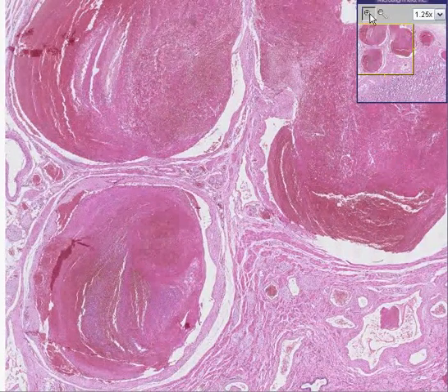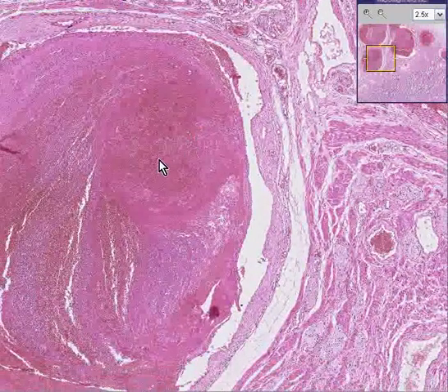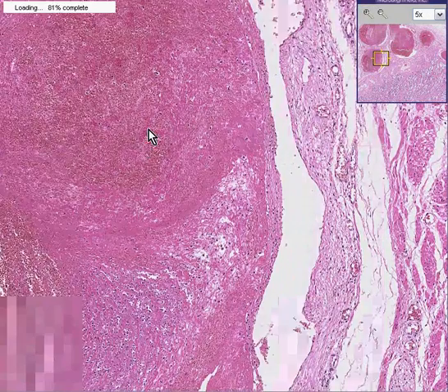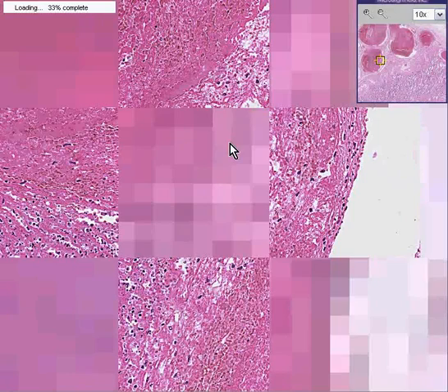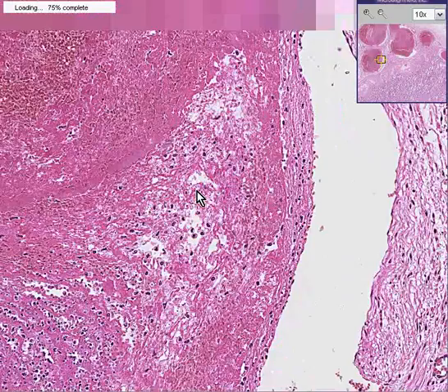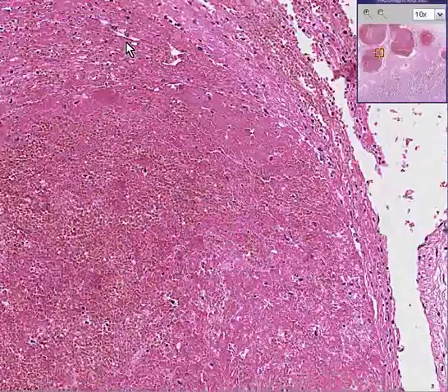And you may remember that when the blood clot looks chiefly like amorphous fibrin and blood cells, we call that a recent blood clot. But when the blood clot starts to get some ingrowth of not only inflammatory cells, but perhaps endothelial cells, like blood vessels are starting to grow into it, we call that an organizing blood clot.